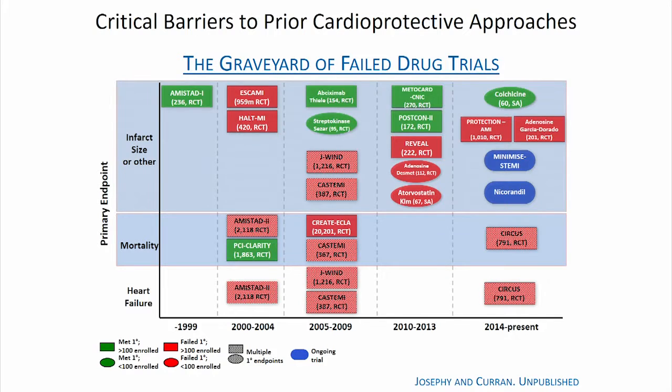So right now we're stopping the myocardial injury clock by reperfusing the artery as quickly as possible. The question was also asked earlier: we've focused on the hemodynamic effects of these pumps, but now the question is, are these pumps actually affecting biology? Are they affecting some of the pathways that have been well established in preserving myocardial salvage and reperfusion injury salvage pathways? That's what our laboratory has been focused on, and a lot of laboratories around the world have focused on this.